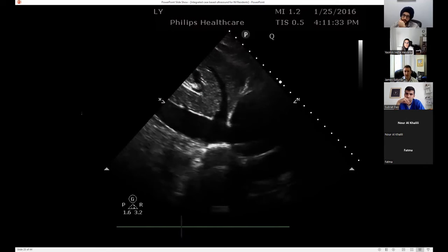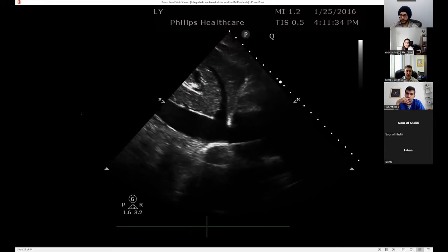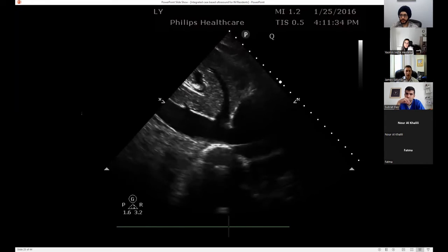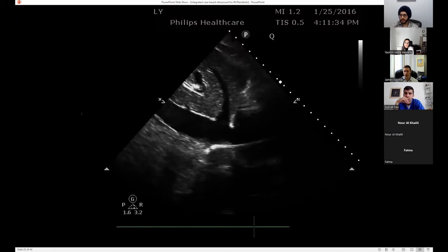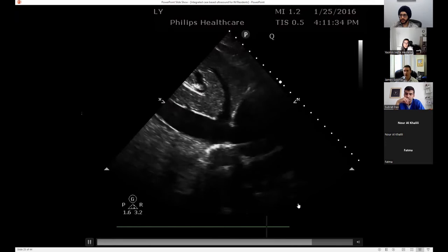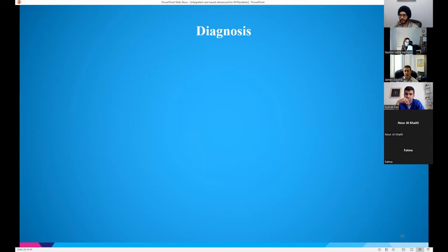In those cases, the vast majority of the time, they will need fluids, and you would want to give those patients fluids. But other than that, unless you have somebody intubated, paralyzed, in normal sinus rhythm with no underlying cardiac dysfunction, no increased pulmonary pressures, you really can't use the IVC as a marker of volume status. But it's very important when you're doing echocardiography and you're trying to look at RV systolic and diastolic pressures and pulmonary pressures. So we talked about a lot.